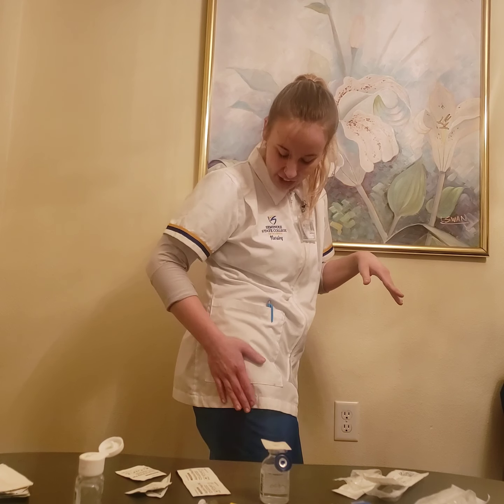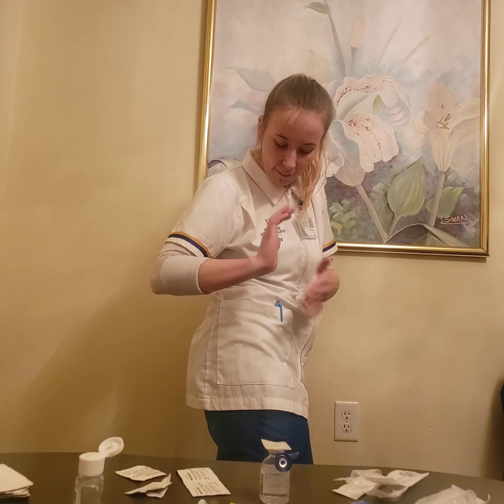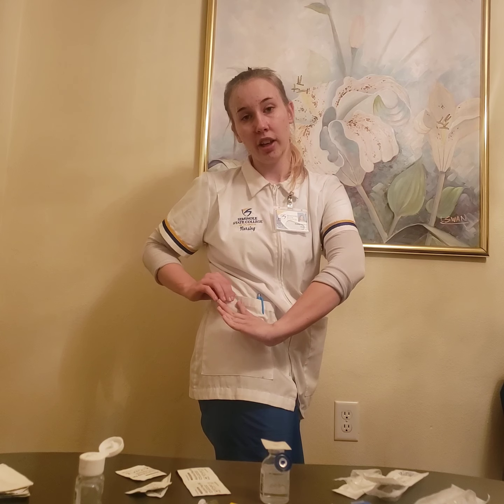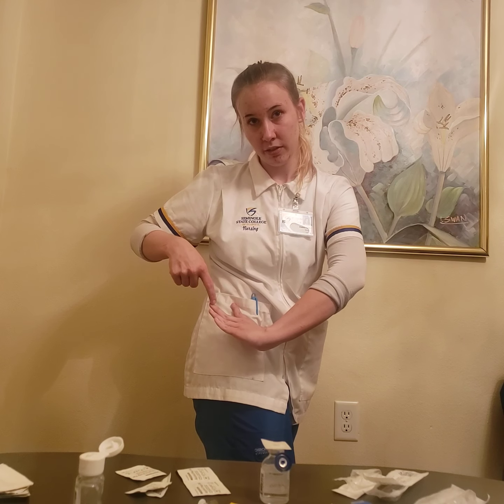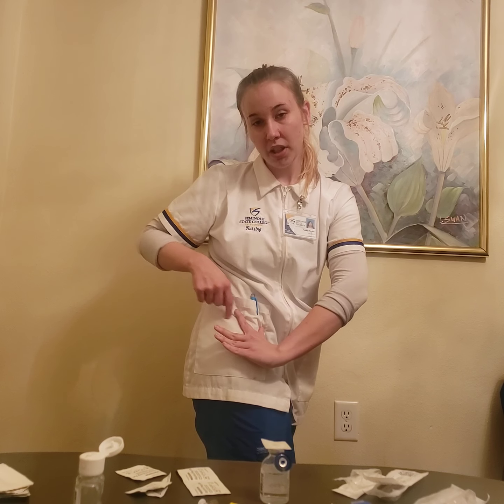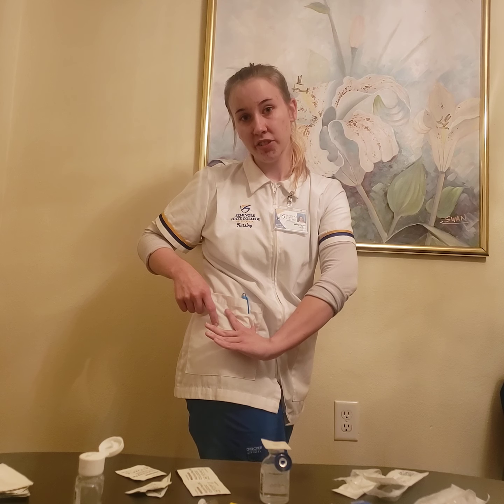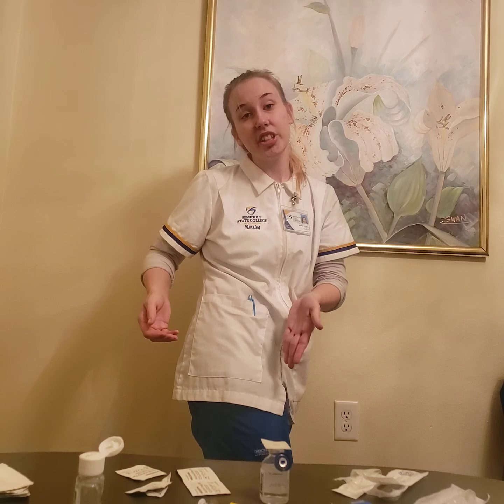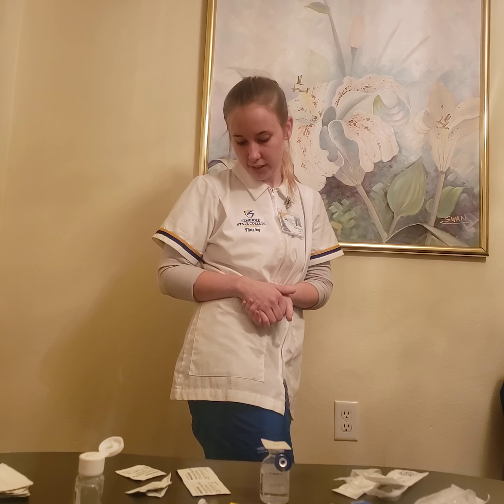And the third would be your ventrogluteal. You're going to be going by putting the heel of your hand on the greater trochanter with your thumb pointing at the patient's groin, and you're going to create a V between your first and second finger here. In between the V is going to be your injection site, and you want to avoid all the nerves in all 3 of these places. And we're using Z-Track for all 3 of these injection sites.